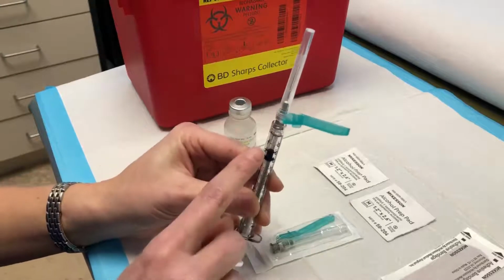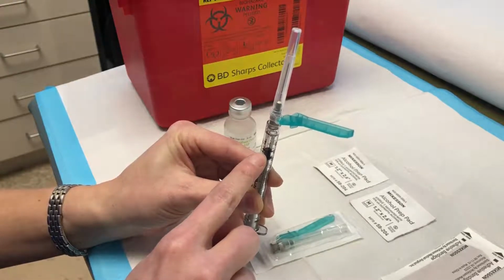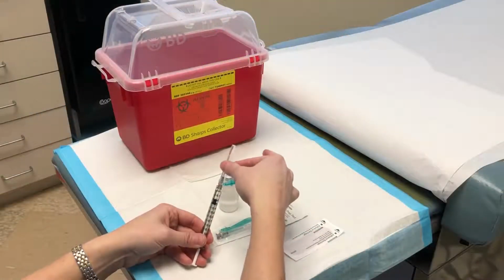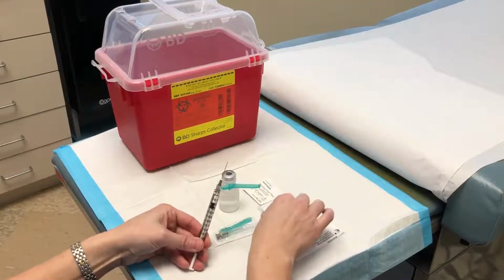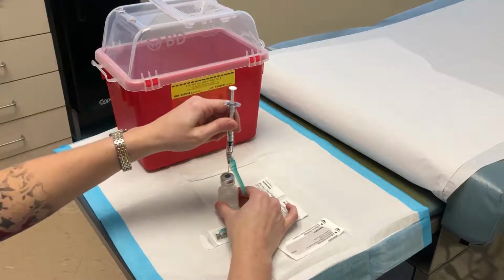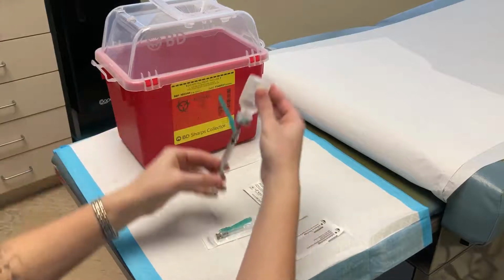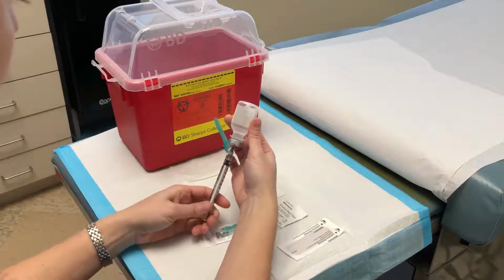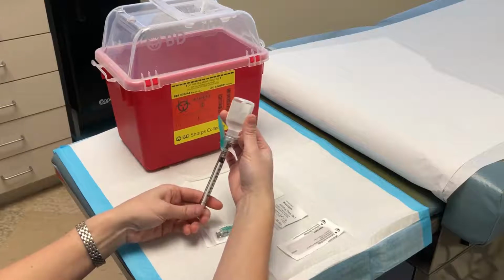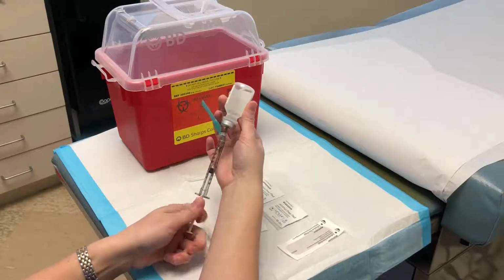So I pull the plunger back to the 0.2 ml mark. Pull the top off of your needle, and then holding your vial on a flat surface, put the needle through the middle of your rubber stopper. Inject the air into your vial, flip your vial upside down, and pull your plunger way past your medication dose, because first you'll just be drawing up air.